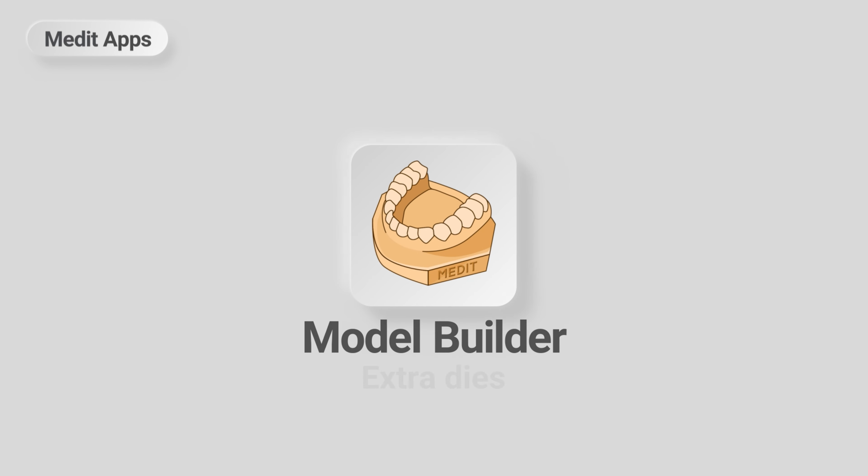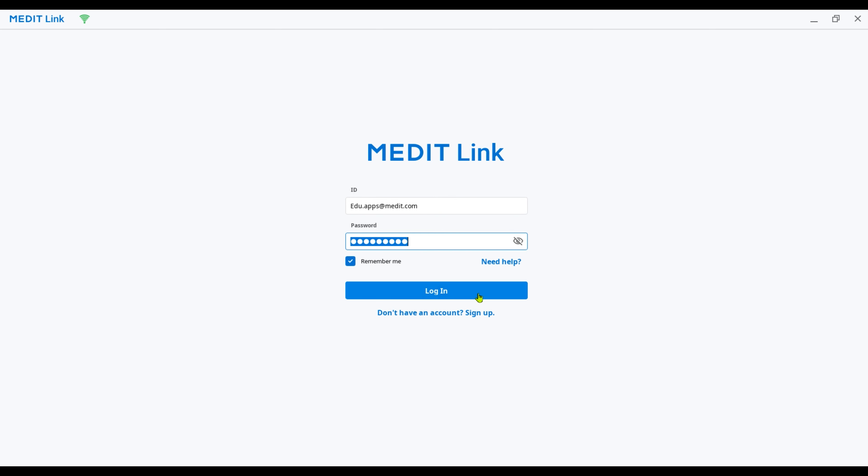This is a quick guide on how to design a model with extra dies using the Model Builder app. First, let's install the app.